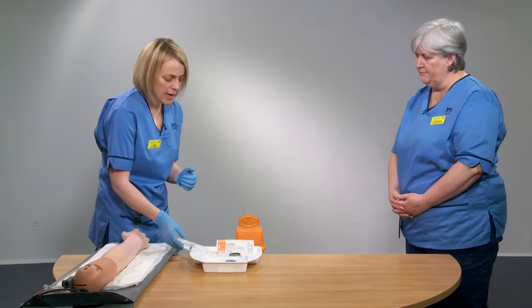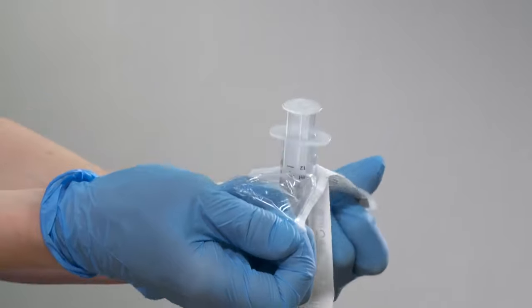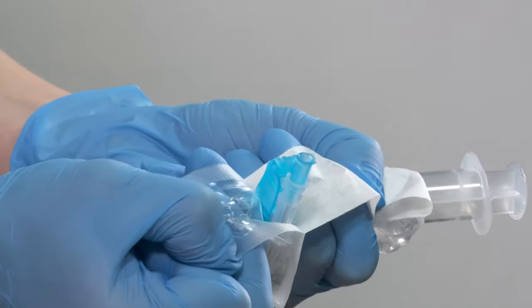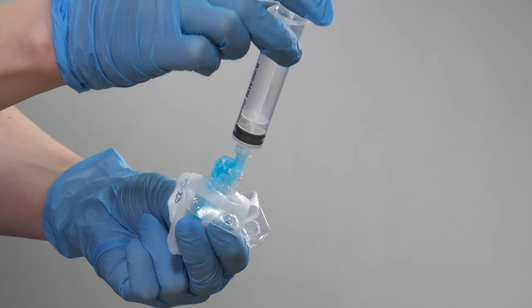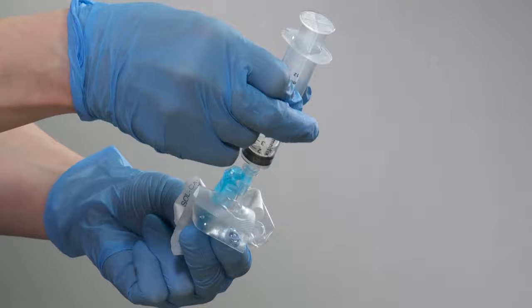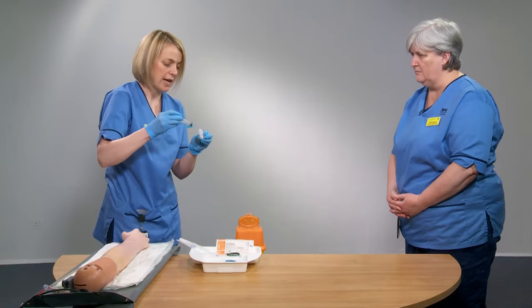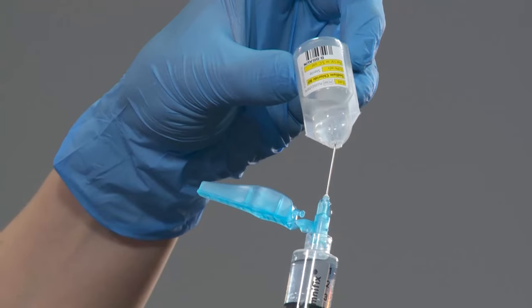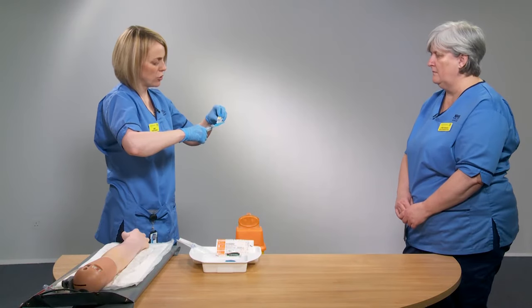The first thing I'm going to do is prepare my flush. I'm going to open my syringe — peel the syringe pack open, peel your needle pack open, and attach the needle and syringe using a non-touch technique. You then want to draw up your saline. You can see here I've got five mils of saline, which is absolutely adequate for flushing a cannula, but you're still using the 10 ml syringe — that's to reduce the pressure within the cannula itself.